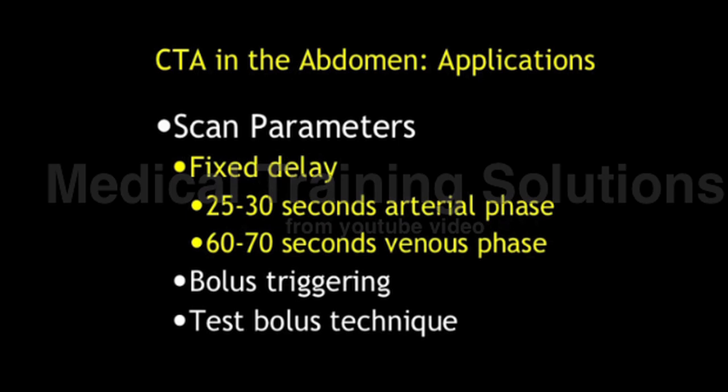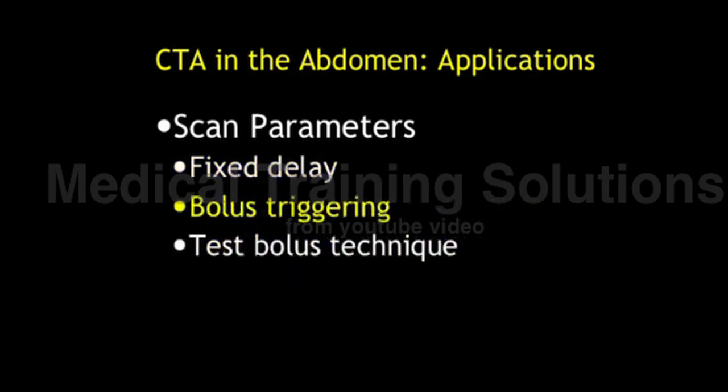You can do bolus tracking. You can do test bolus. We never use test bolus in the abdomen. We tend to use test bolus only for cardiac. So we'll do bolus triggering.